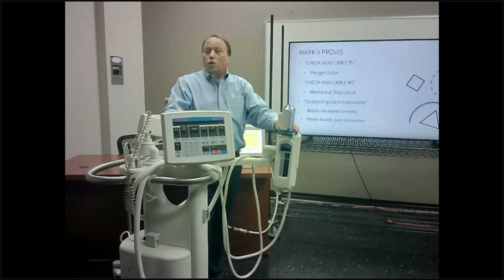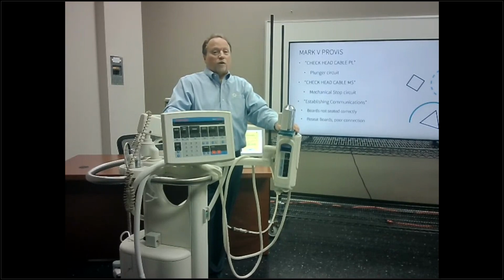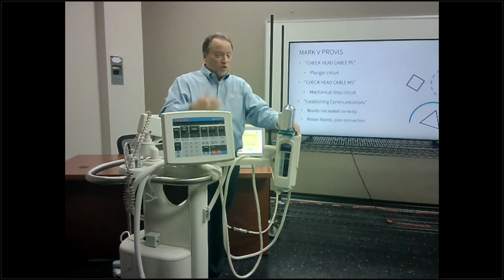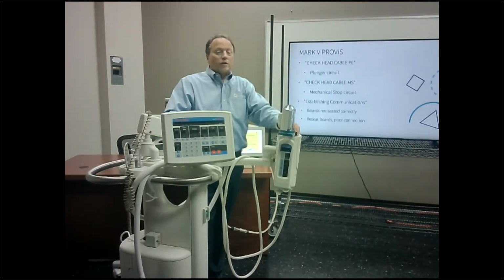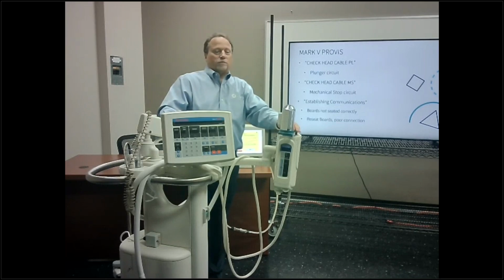Make sure the boards are pushed in firmly. If you were just doing a PM and you get an establishing communication, you check your boards. I was working with one guy and he said, I checked my boards. Check them again. He wasn't pushing them in all the way. These are very hard boards to pull out and push in. You think they're in, but they're not. I had some guys say, it feels like I'm breaking it. Well, push a little harder, and guess what? It fixed it. So reseat the boards.